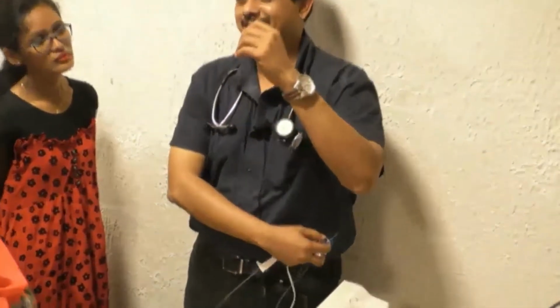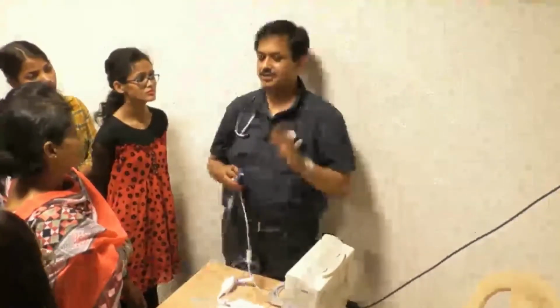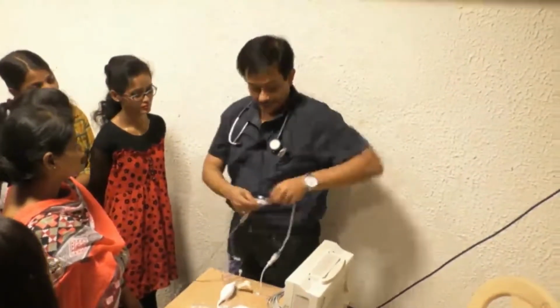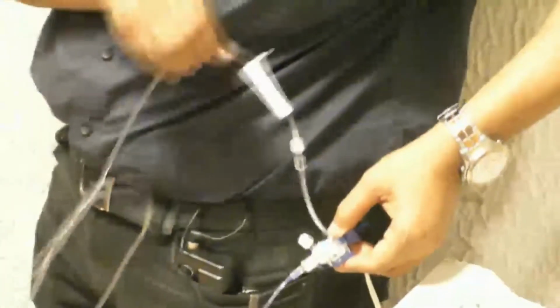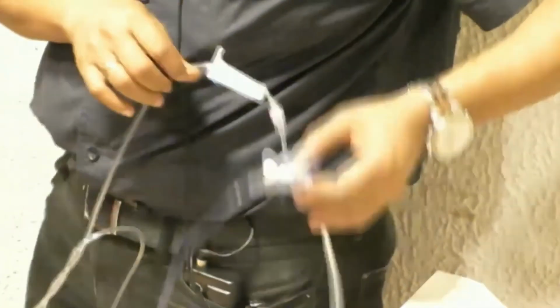Reason? Always find the reason, then it will be easier, there is no guesswork. Because I have zeroed it at this level, right? And it is reading the level of the pressure. Now, if it is lower, it will also record the hydrostatic pressure, the pressure of the fluid column. And if it is above, lower pressure will be recorded.